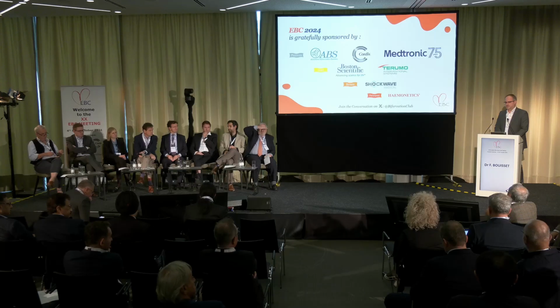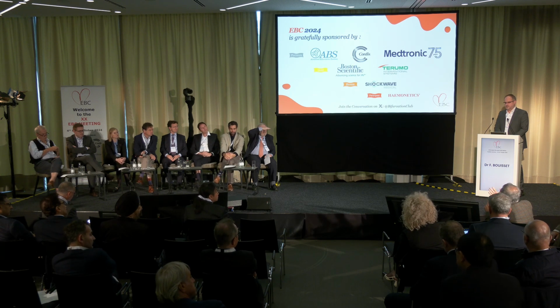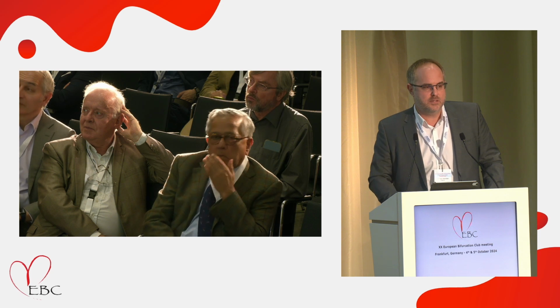One of the things you've not taken into account is a large acute RV marginal branch that you might jail in right coronary stenting, or a diagonal that you've left that can cause symptoms, not only symptoms but sudden cardiac death, or a large acute RV marginal branch being jailed, causing RV infarction. So where does that fit into the picture? Yeah, that's true. That's a limitation of this analysis. We are only taking into account left ventricular mass, not right ventricular mass.